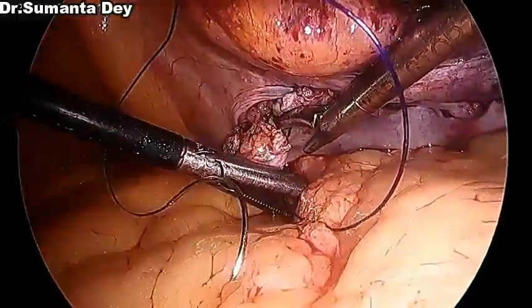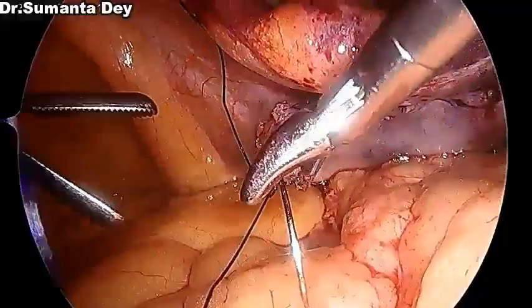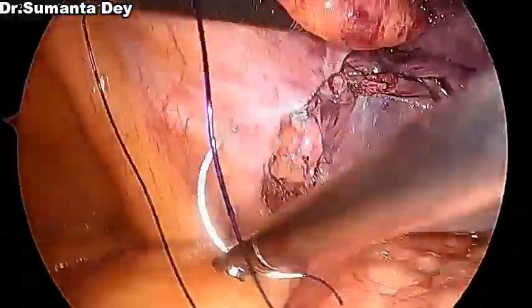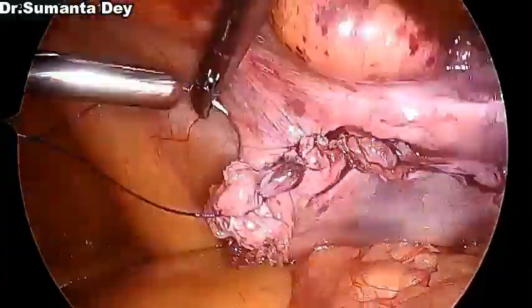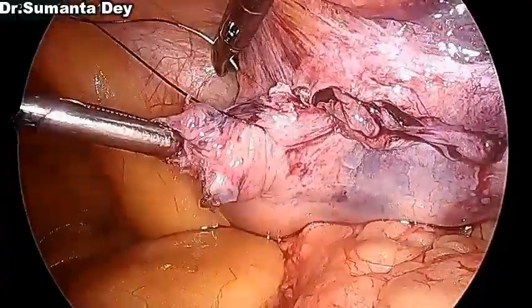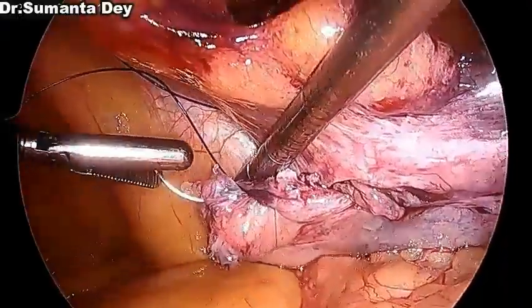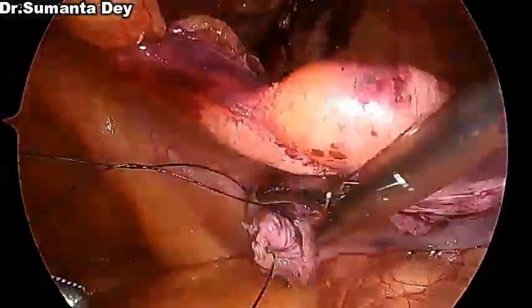What I felt during the closure is that initially I was closing the peritoneum from the inside of the pocket. Later I found that once I'm going down, it is ergonomically easier to close the peritoneum from outside the pocket. So I came outside with the same suture and finished the peritoneal closure. No part of the mesh should be exposed.